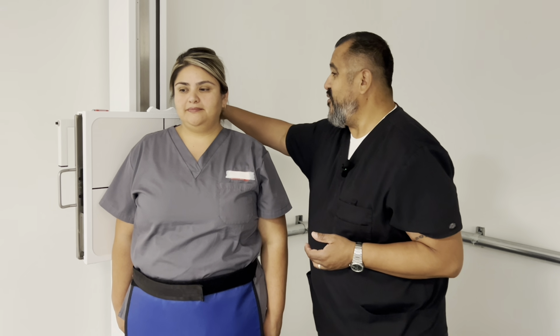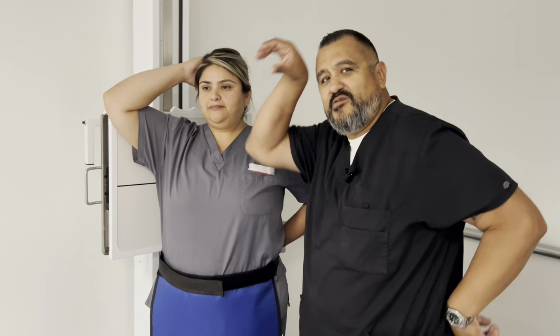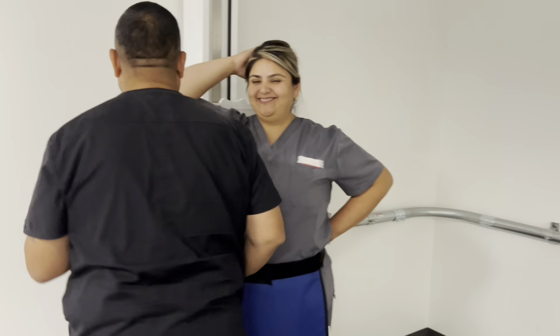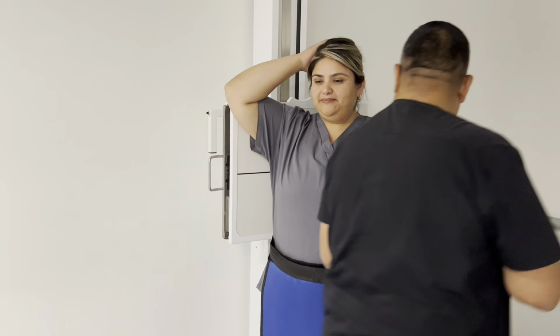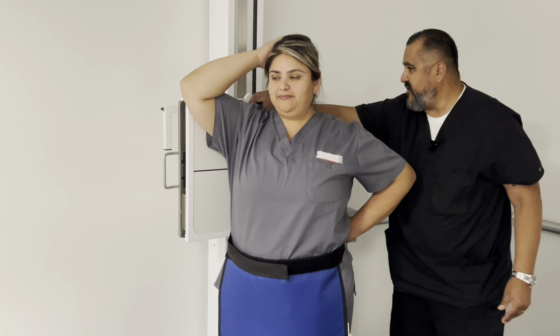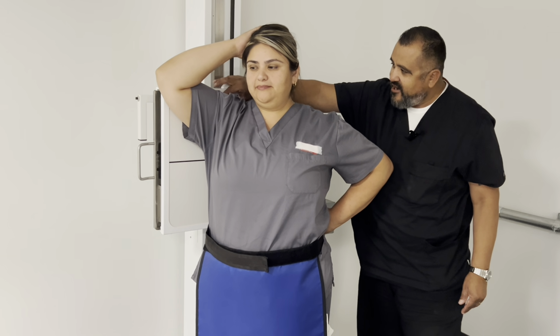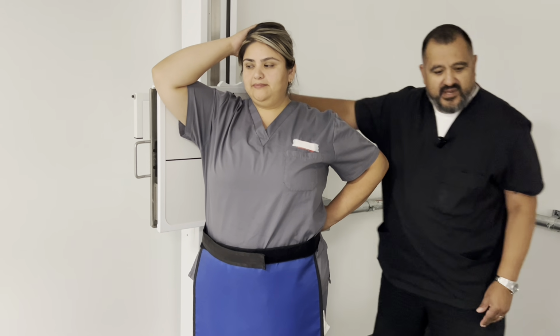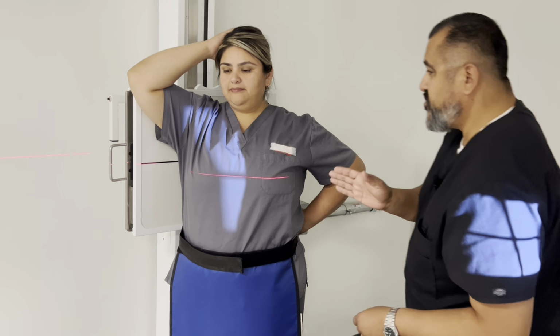So now we're going to do an RPO, and we're going to raise this arm up. This arm's going to go back, kind of like I'm a little teapot. That's the last time you're going to see me do that. All right, so we're going to put this right marker here. I'll put it right by the head of the humerus, right below it, right where the IR is at, not in the anatomy of the lung, but still. All right, so now we're going to shoot through.